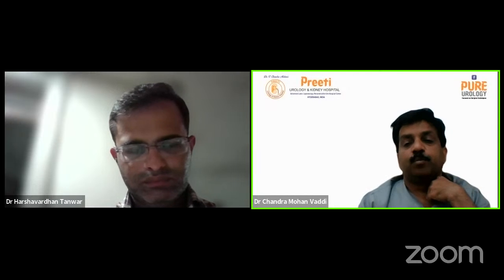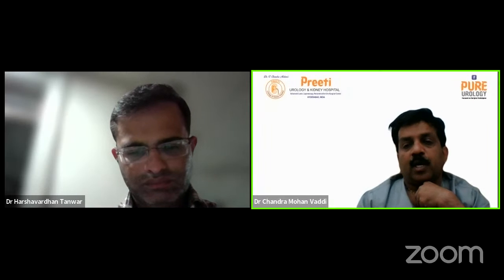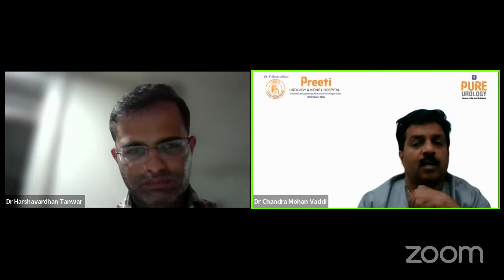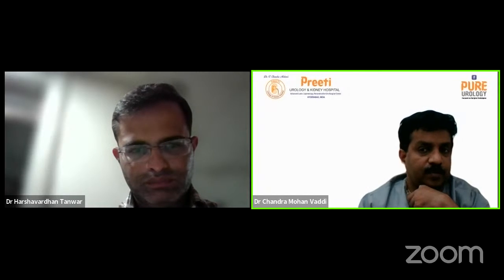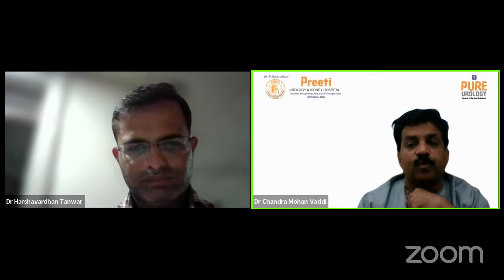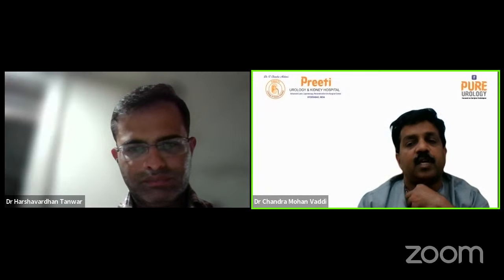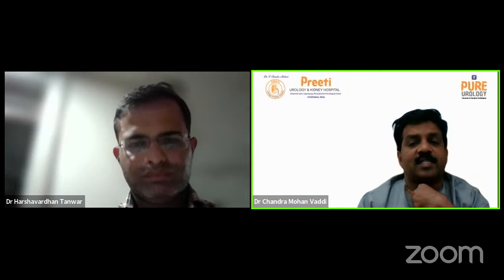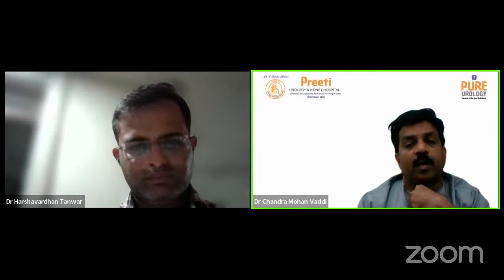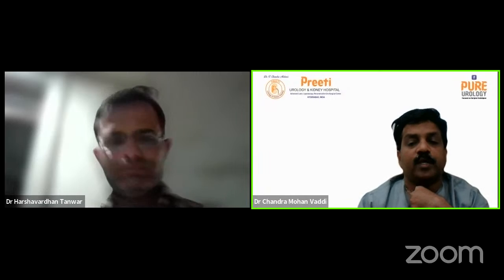The posterior calyx in prone is always better because it is superficial. If it is superficial, if it is lateral, it is better. Superficial is given more priority than lateral. So in the entire discussion, if you can enter the kidney superficially, the chances of a vessel coming in your area are very less. The tract is shorter, and the ability to move in the kidney without torque is good.